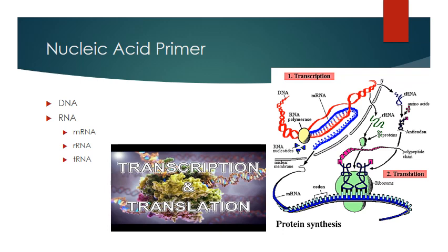But we have to remember the nature of the target that we're looking at. Is it DNA? Is it RNA? Is it messenger, ribosomal, or transfer RNA? Most of our targets will require some kind of pretreatment based on their source or whatever the target nature is, so that we can amplify our chances of actually finding that little thing that we're looking for, the needle in the haystack.